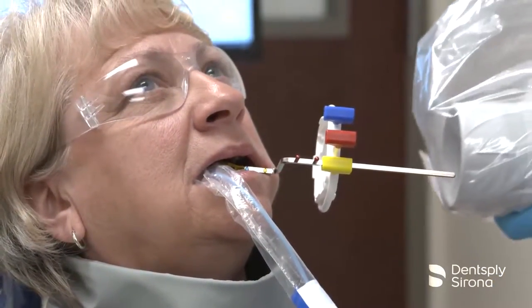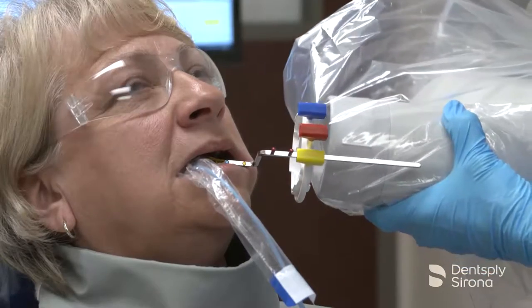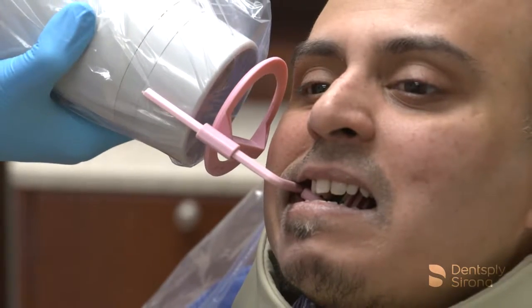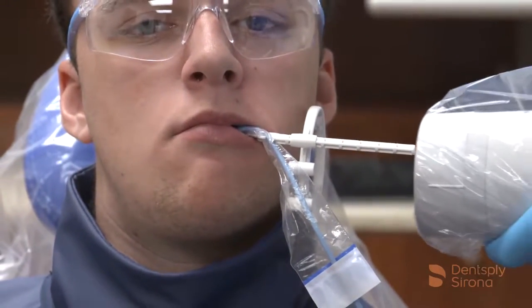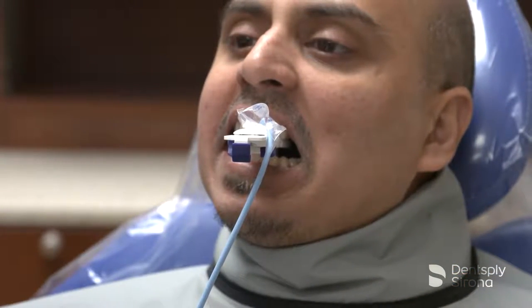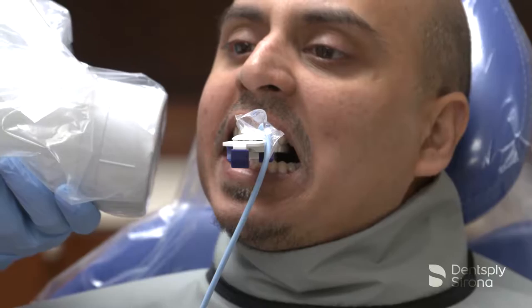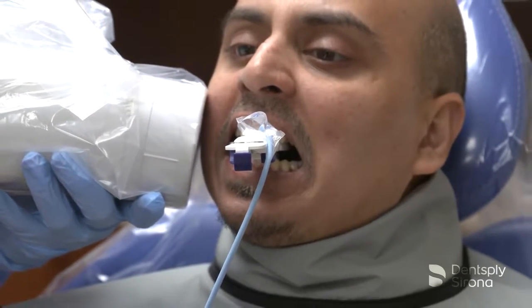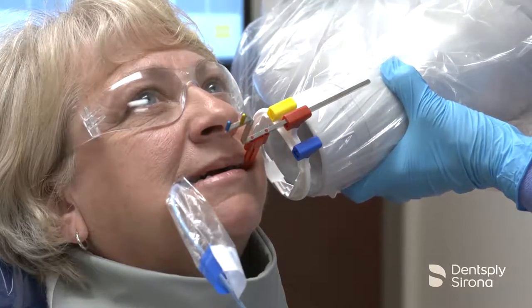Dental radiographs are valued diagnostic tools when the image quality is adequate enough for proper interpretation. To do this, it is imperative to correctly place the image receptor in the mouth and ensure that the primary x-ray beam is centered and aligned correctly in both the vertical and horizontal angulations. At this time, it is crucial to minimize patient exposure to radiation. Successful images require the use of careful technique and precautions to maximize their diagnostic and interpretive value.